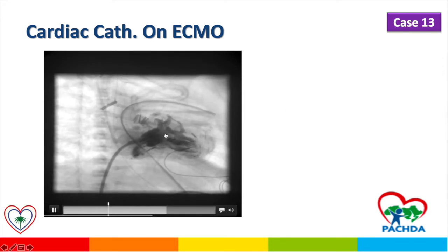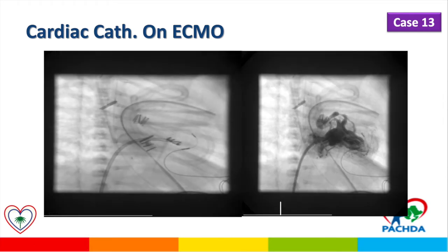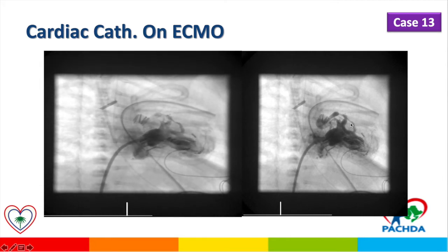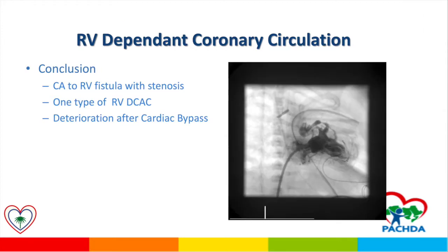Injection in the right ventricle shows multiple connections with the coronary artery, with multiple stenoses in the course of the coronary artery. Still images confirm the same finding with multiple stenoses. Another view shows a fistula between the right ventricle and the coronary artery with stenosis. This patient has RV-dependent coronary artery circulation and deteriorated after cardiac bypass.